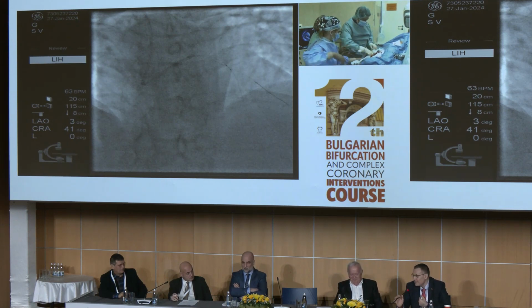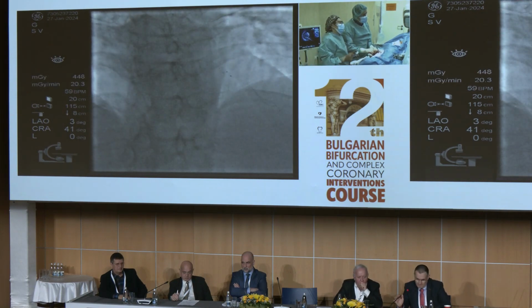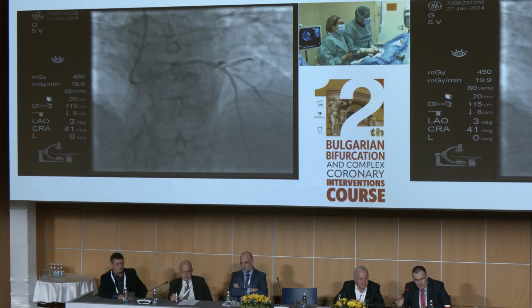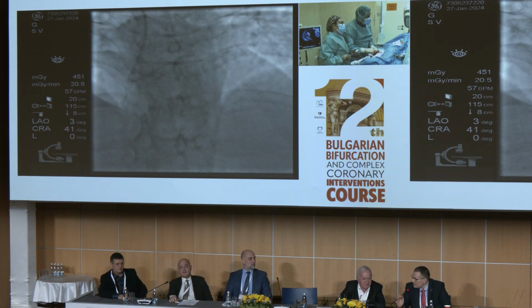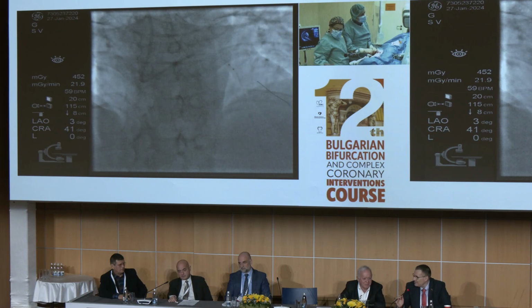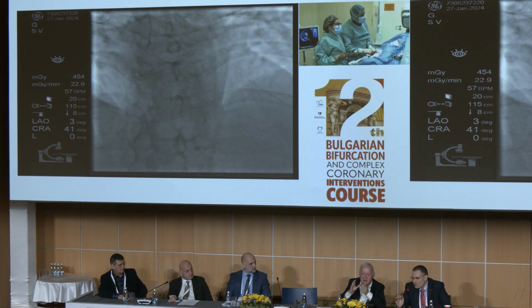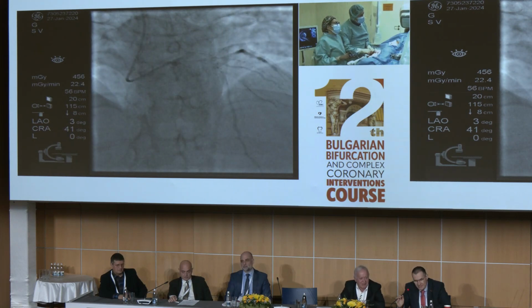In our lab, we were one of the first centers which tested this balloon, not only in Bulgaria. The balloon is without cone. It is purely cylindrical, really cylindrical. The marker is not far from the distal part of the balloon.